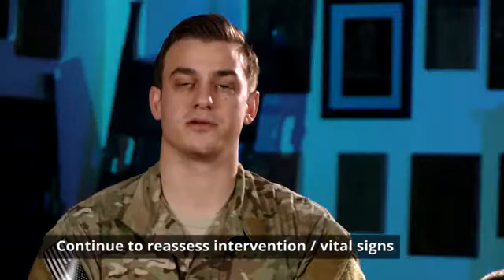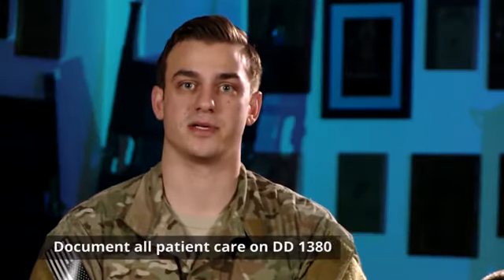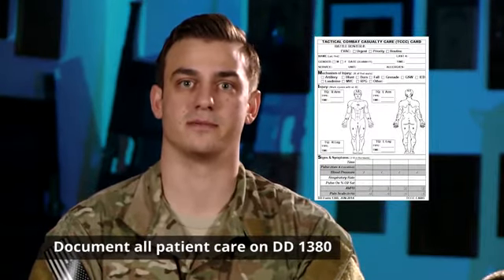Continue to reassess your intervention, assess the casualty's vitals, and document all patient care on DD Form 1380.